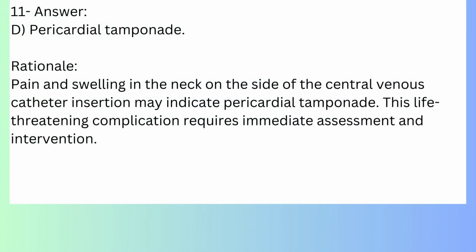Pericardial tamponade. Rationale. Pain and swelling in the neck on the side of the central venous catheter insertion may indicate pericardial tamponade. This life-threatening complication requires immediate assessment and intervention.